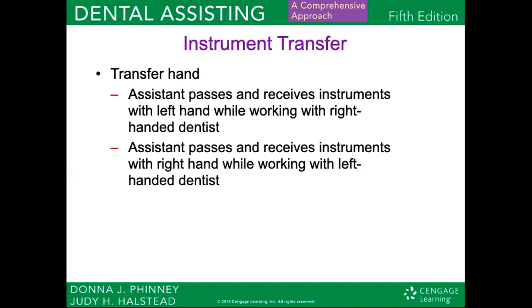The assistant passes and receives instruments with the left hand while working with the right-handed dentist, as far as the transferring hand goes. If you're working with a left-handed dentist, the assistant passes and receives instruments with the right hand while working with that left-handed dentist.